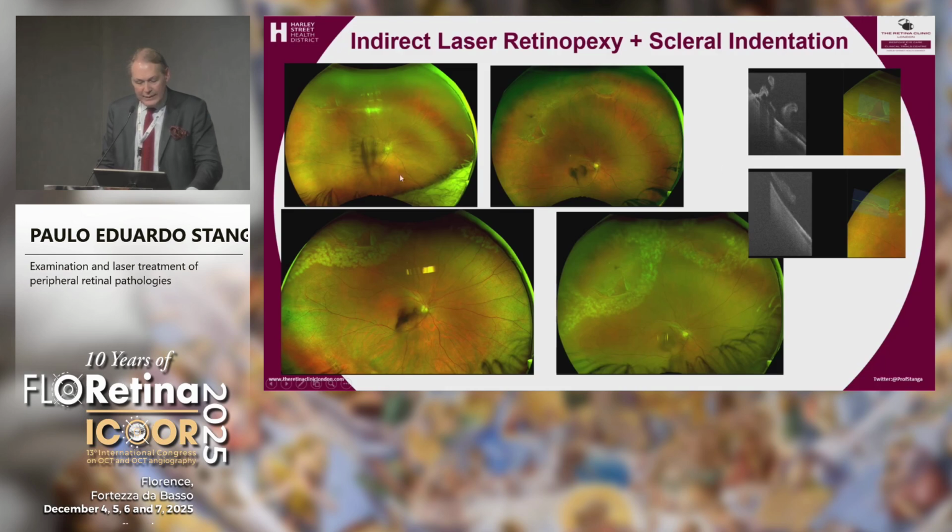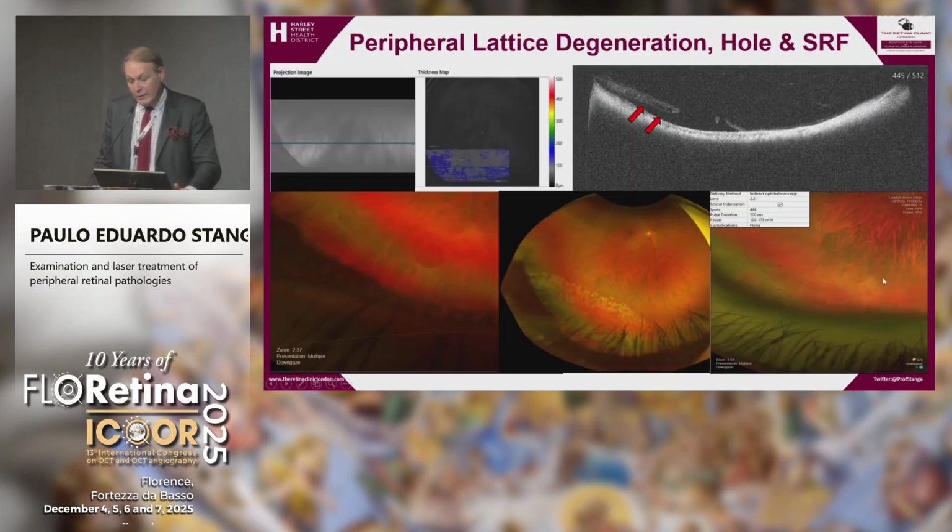This is another example. Look, this is even a subclinical retinal detachment. There's a large tear there, subclinical retinal detachment. This was asymptomatic. The patient was not symptomatic of loss of vision. Once the patient is symptomatic of loss of vision, I don't even think about doing laser. I think about a vitrectomy surgery, of course. But this patient did not want surgery. I thought, well, look, this is superior, there's already a lot of fluid, it may not work, but it did work.